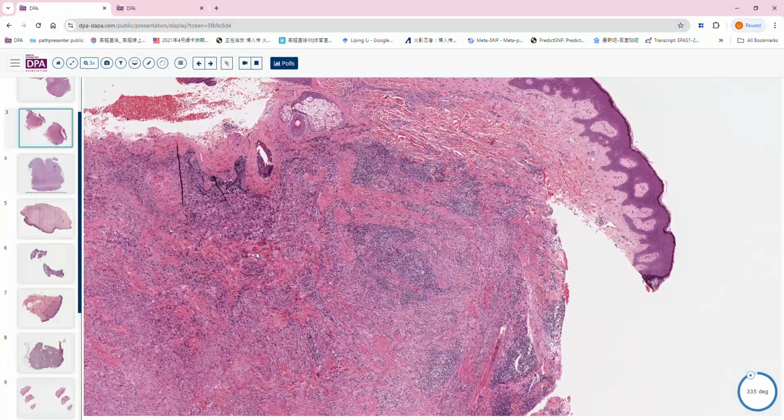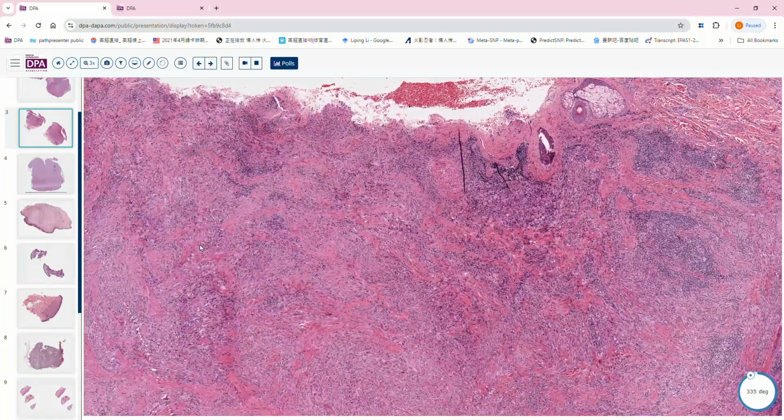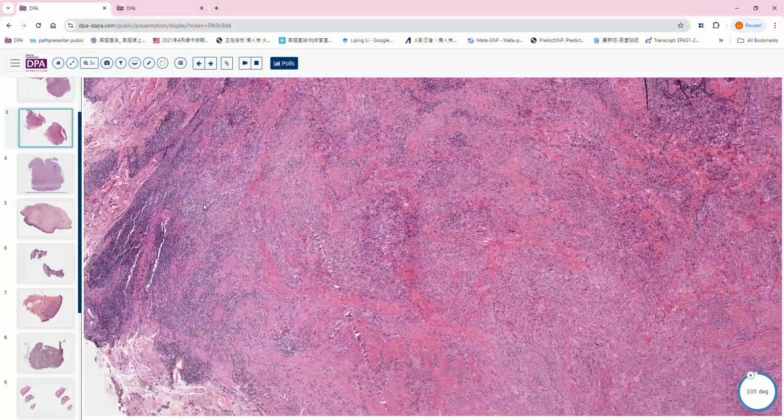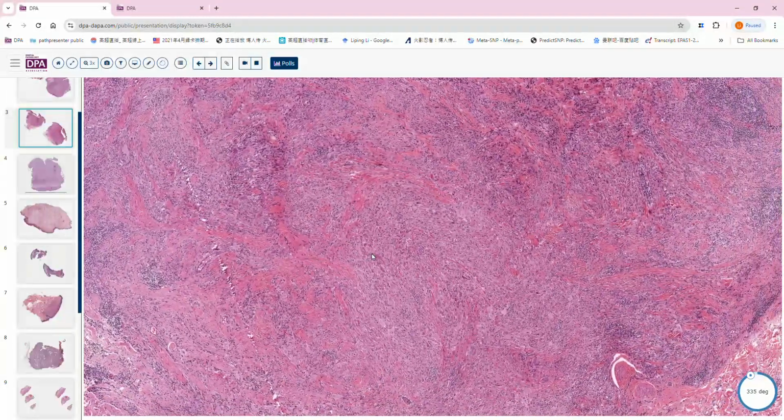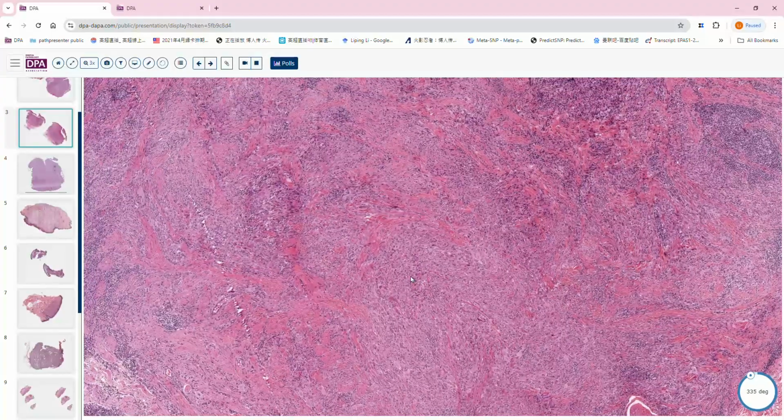There is debris on its surface. You can think about xanthoma as well, but the cytoplasm helps out with that. Yes, that is the reticulohistiocytoma. As mentioned, if it's a single lesion, don't worry about it. If multiple, you need to think about any systemic disease. Then we have a really good differential when we have all three things. I would like to differentiate them, so we can just continue.